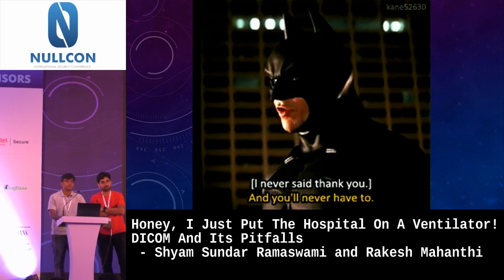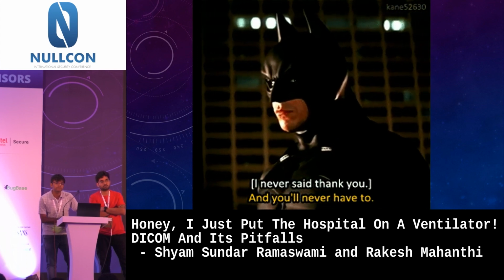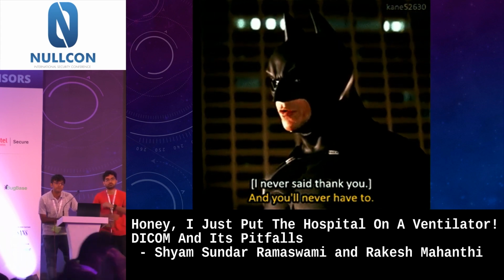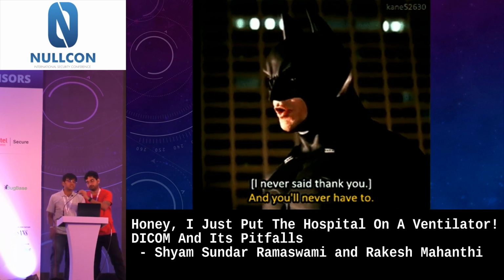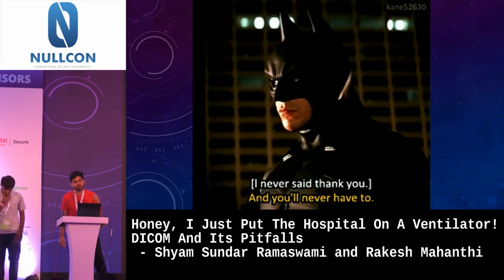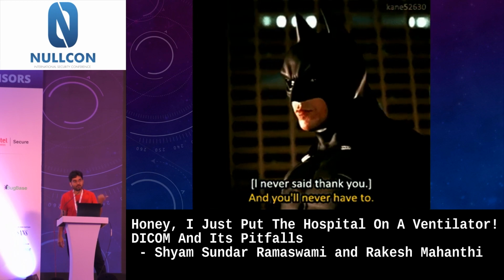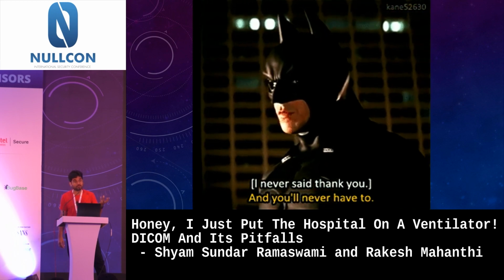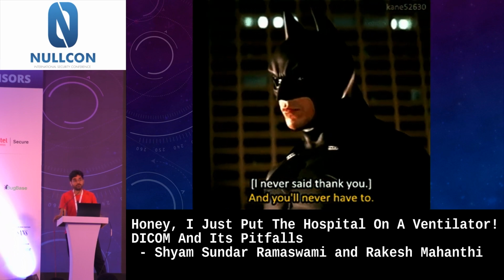And the DICOM files, when they get dropped on the PACS server, the malware is going to get executed on the doctor's computer or whoever opens it. Correct, it's on the client side. But that's the sanitization point where we want to put the solution, so that wherever the PACS server is saving and moving files, we calculate the value of the file and see how sane it is before we store it. It's going to run pretty much everywhere, and defense in depth matters.